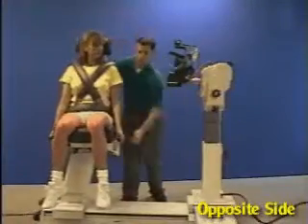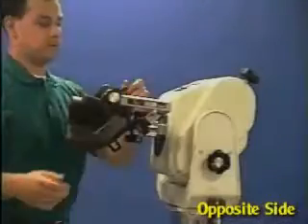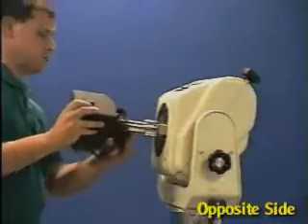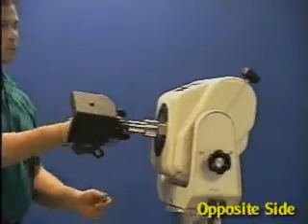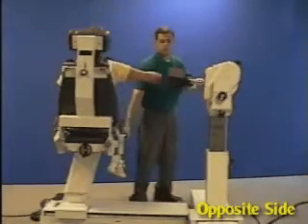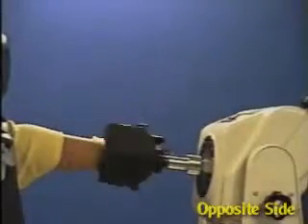Slide the chair back and rotate it to zero degrees on the opposite side. Remove the fixture, rotate it 180 degrees, and reattach it to the shaft. Slide the dynamometer into position. Move the patient into position, verify the axis of rotation, and set range of motion limits.